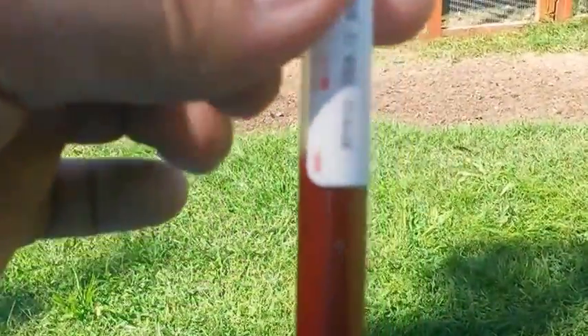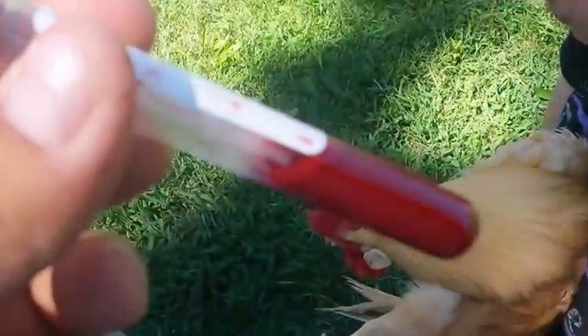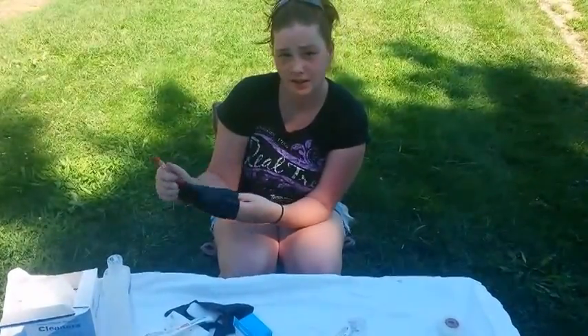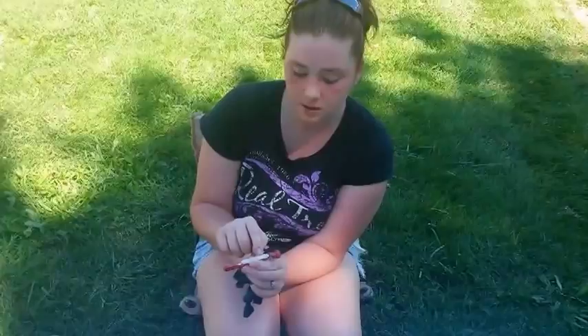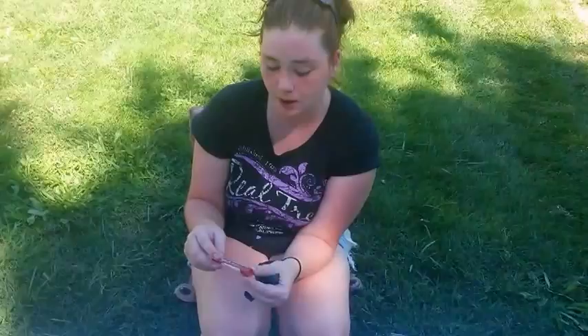And there's your blood, ready for testing — and he's done. This is how you draw blood for many different samples that your state vet may need for NPIP. As you see, they'll record this number on my tube, and I have my book for my NPIP that states what bird matched with what tag. If anything was to show up, I can go back and look and call that bird out.